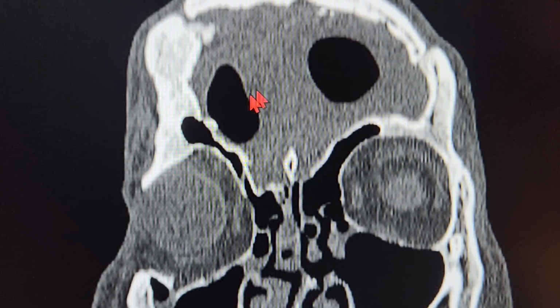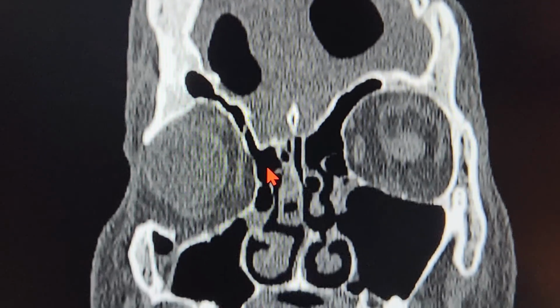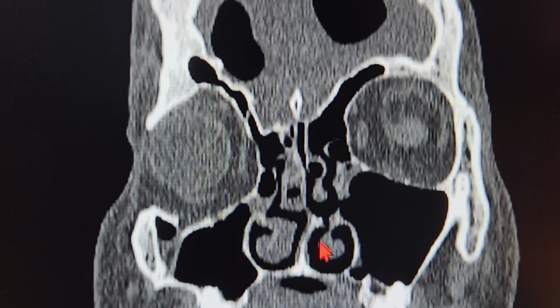So you can see that's the air foci, pneumocephalus. That's the hyperostotic, thickened, fibrotic skull you can see inside. As we keep on going behind, that's the normal skull base. You can see behind, there's no breach in the skull base here. The nasal anatomy looks quite normal, with a little bit of spur on the patient's left side. So we may not take the flap from the patient's left. We will try to take it from the patient's right only, and we'll try to take a rescue flap just to be safe from the left side.